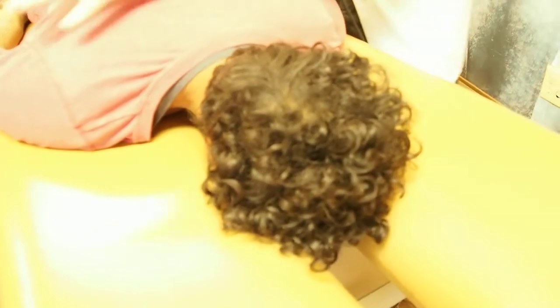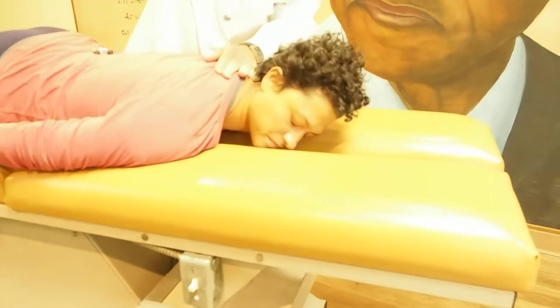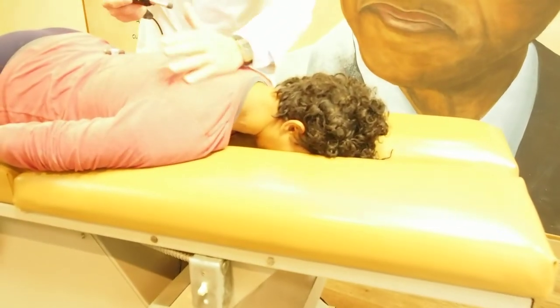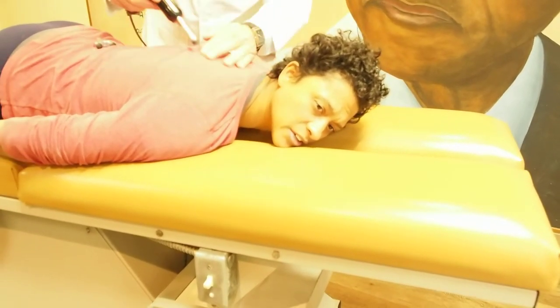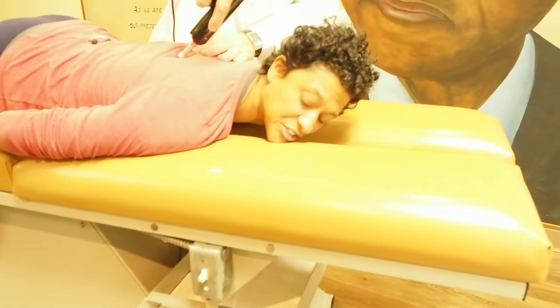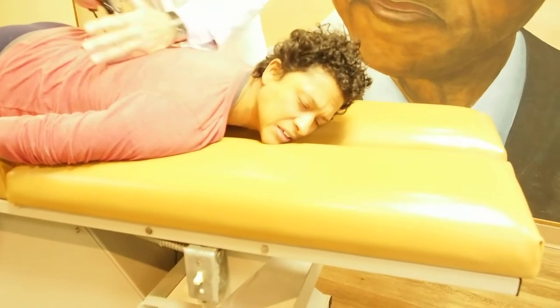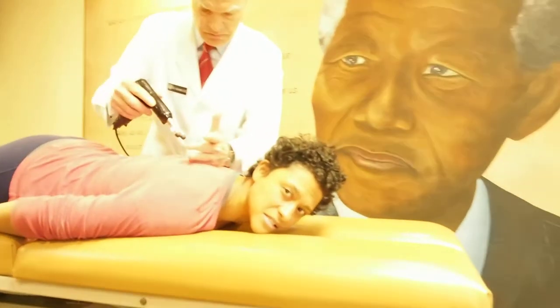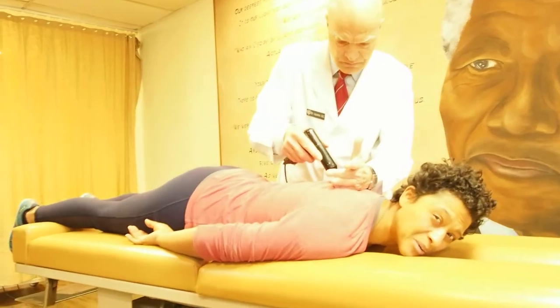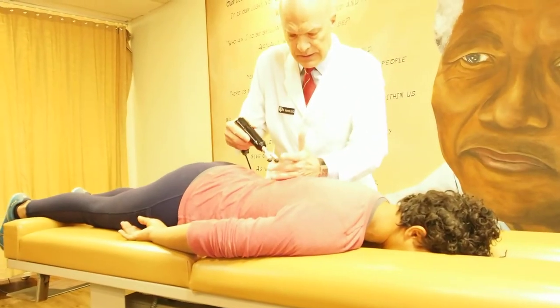I'm working on her shoulders and muscles. People are concerned about getting their necks cracked and are reluctant to go to the chiropractor. She says with this tool she doesn't feel pain or a large amount of force being applied, so she has confidence she's not going to be injured — it's really helping put her vertebrae back into alignment.